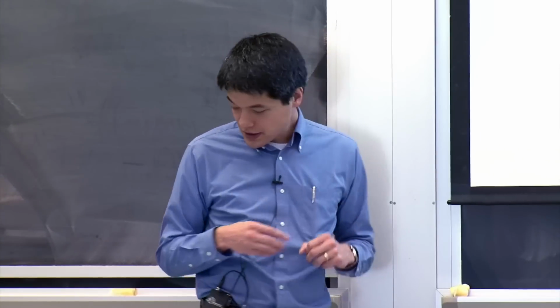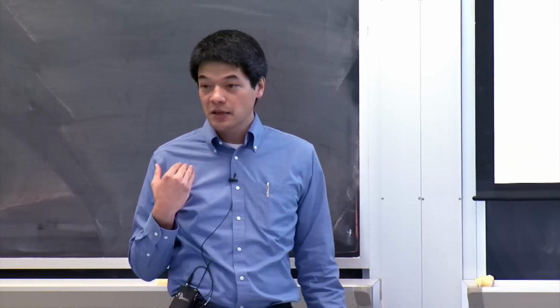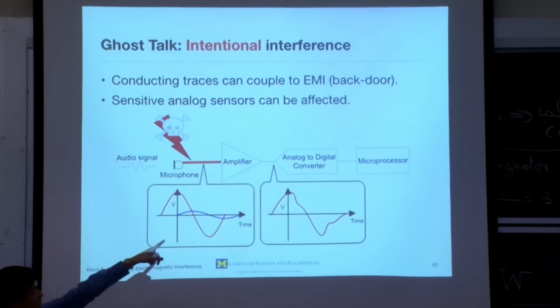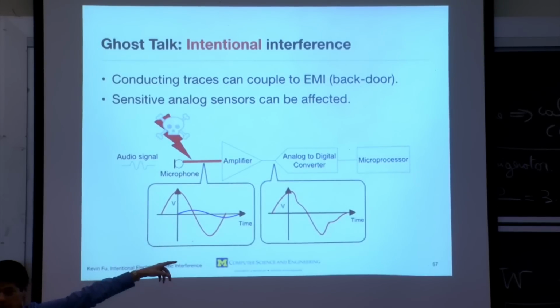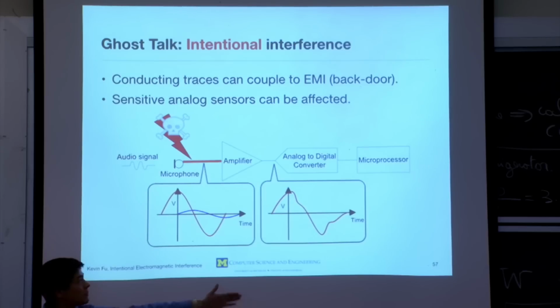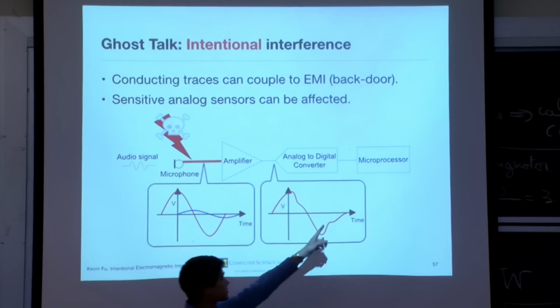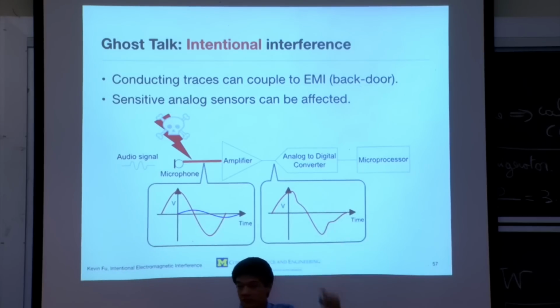And so I started to look at the block diagram. For instance, if you've got a Bluetooth headset, what you're going to find inside that Bluetooth headset is a microphone, a piece of wire, an amplifier, some more wire or some traces on a PCB, goes to an analog-to-digital converter, there might be some filtering, and then it goes to your microprocessor. But there's all this other stuff that gets in the way before it gets to your software. And for some reason, your software just believes anything this wire says.